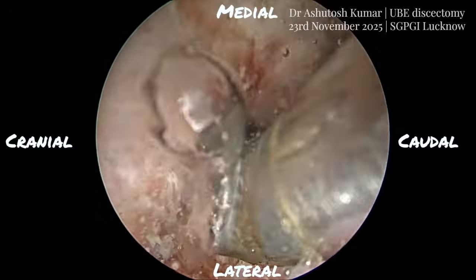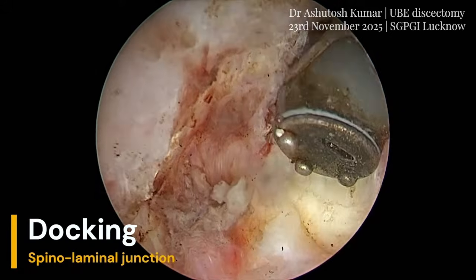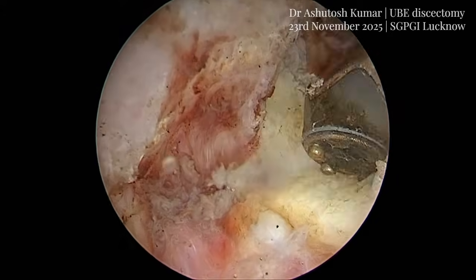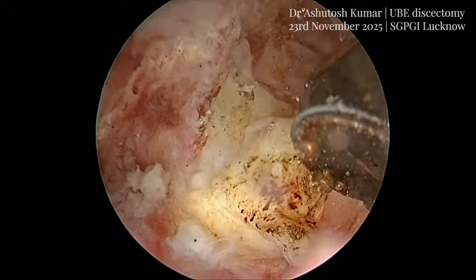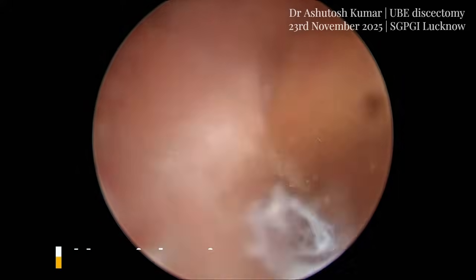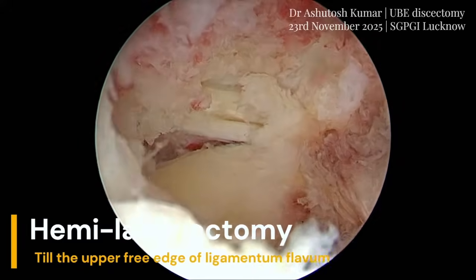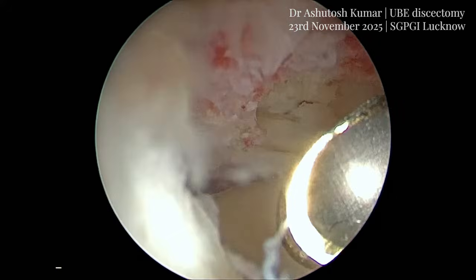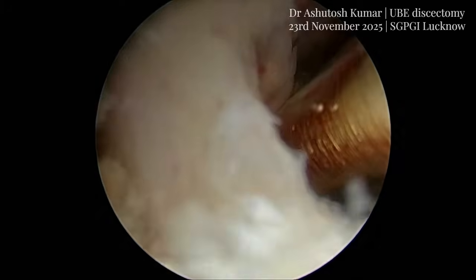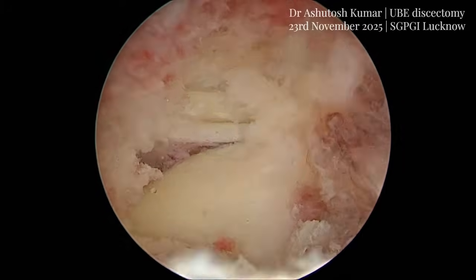The patient was positioned prone and docking was performed at the L4-5 spinolaminar junction. Soft tissues within the interlaminar window were cleared to expose the inferior border of the upper lamina and the superior border of the lower lamina. The lower edge of the upper lamina was drilled to expose the upper margin of the ligamentum flavum. Partial drilling at the root of the spinous process was carried out to facilitate contralateral access, which also exposes the median fissure of the ligamentum flavum.